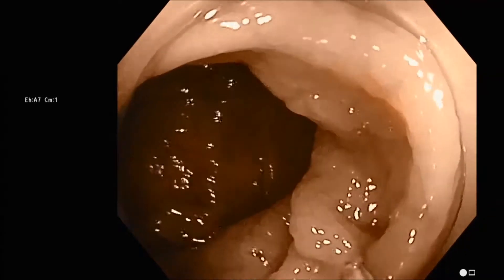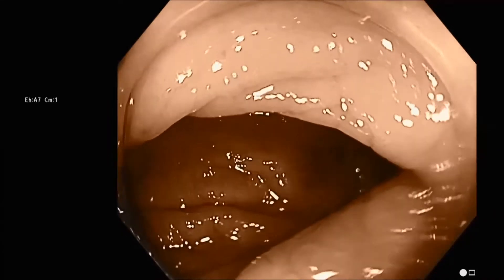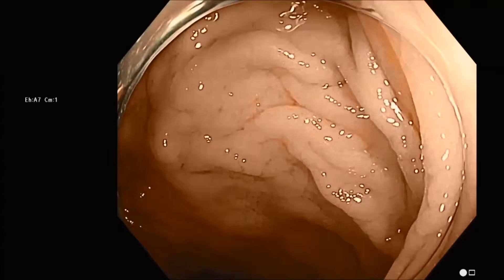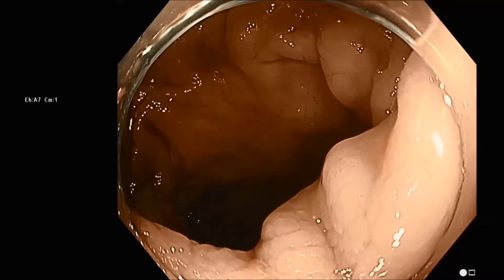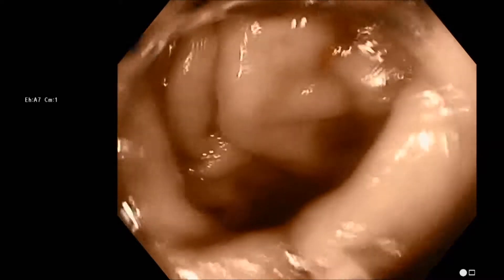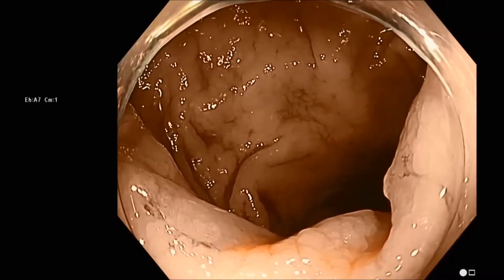We are going to use the bleb technique, and we want to mark the colon usually in three or four quadrants so that the surgeon can easily see at least one of the tattoos from the peritoneal cavity. We want to get on the anti-mesenteric side of the tumor with at least one injection. I like to try to keep the tattoos at the same level — some people get them spiraling down the colon away from the tumor. So try to use the initial injections as a marker so you end up with a ring at pretty much the same level.